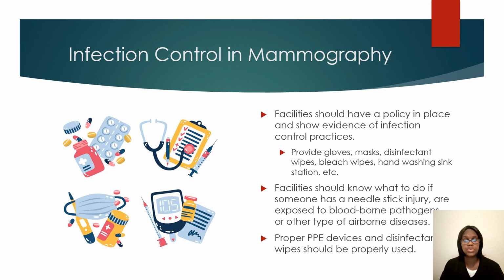Now, infection control. It is very important to make sure that you are wiping down your mammography equipment. I like to wear gloves whenever I take my images. That's just me. That's just what I like to do. I like to have on gloves. And then you also want to make sure that you wear your mask when needed.